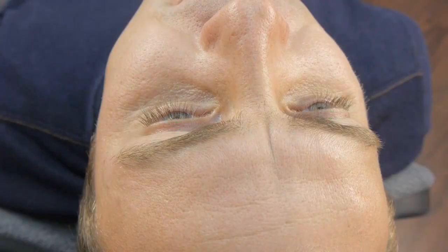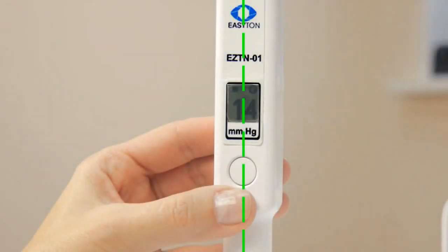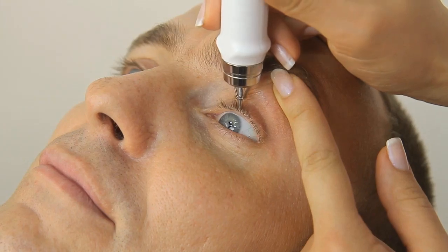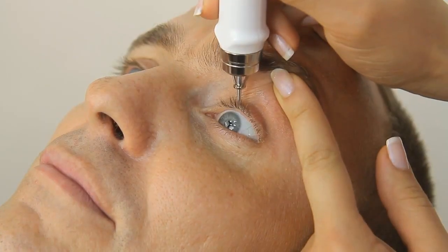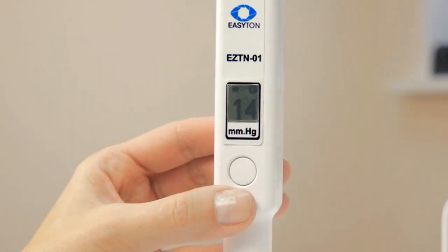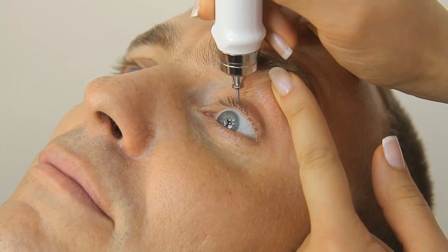Several measuring spots are recommended, which are convenient both for the doctor and patient. The measuring procedure: place the tonometer vertically down. Gently lower it by 2 or 3 millimeters until it makes a single beep. Do not push the device down too hard. The protective ring should be 2 to 3 millimeters above the eyelid surface while measuring.